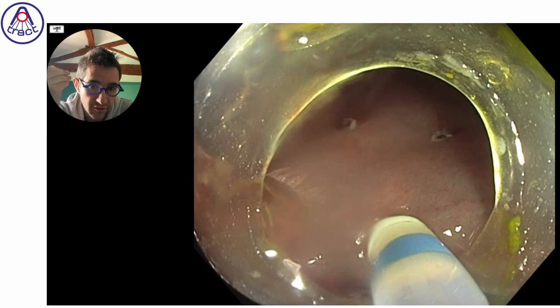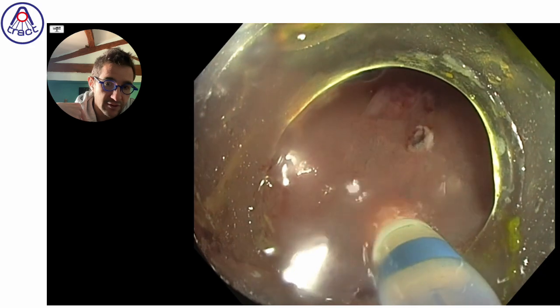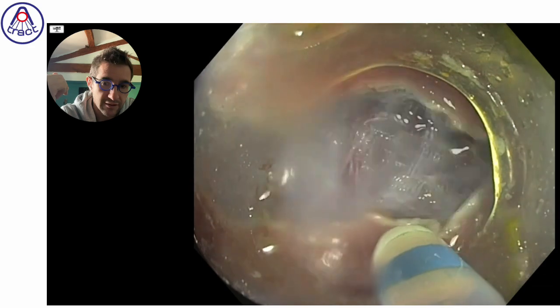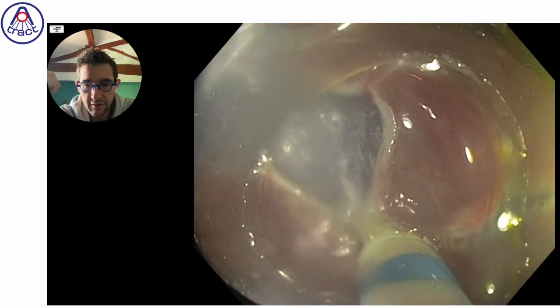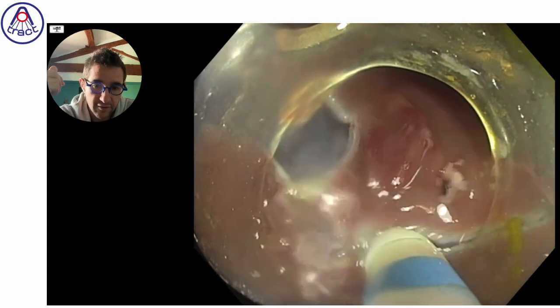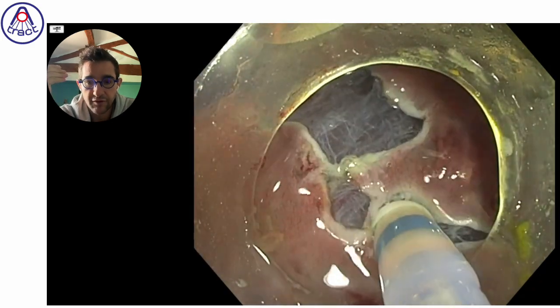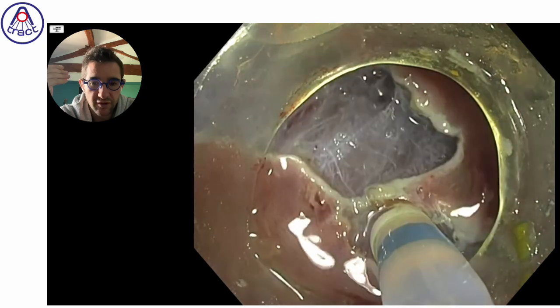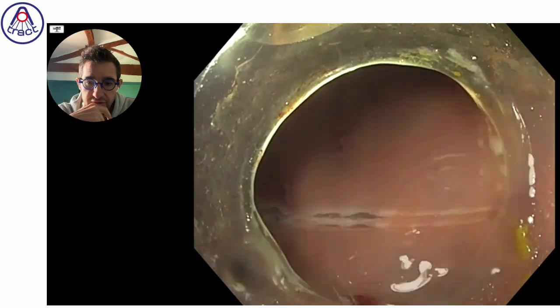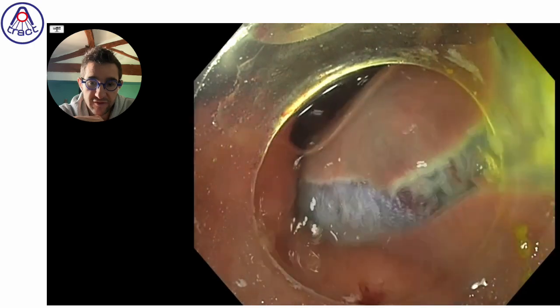You can see the incision on the left area. My points of injection are here. And finally, it will be okay, slowly, because the maneuverability is not good and the scope can slip at any time. So finally, we did it relatively slowly, completing the incision completely. You should not leave bridges like this because it makes the end of your resection not so easy with these fixing points. And therefore, the incision is complete and we will be able now to fix the traction.